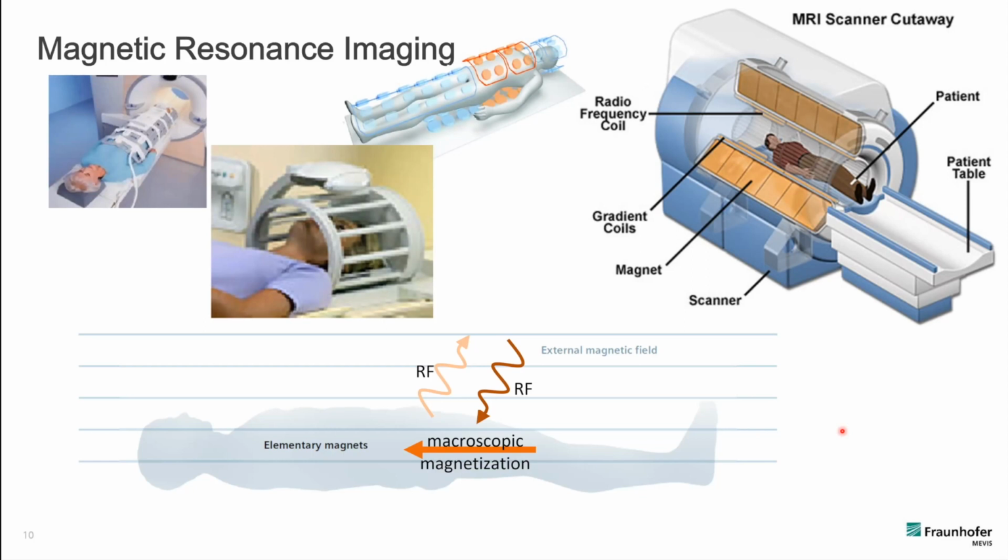It has the same frequency, and we will get exactly this signal back. That will be much lower than the signal we are using for the transmit part, and that becomes important for our metamaterial as well. I'll come back to this in a few minutes.